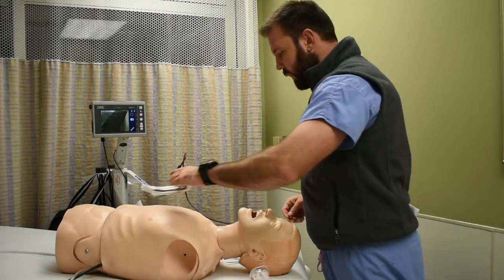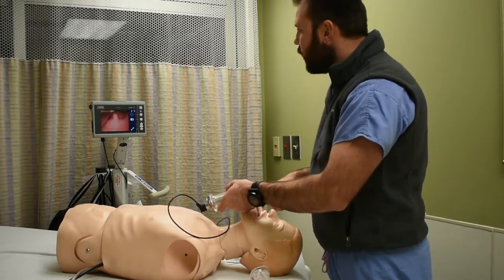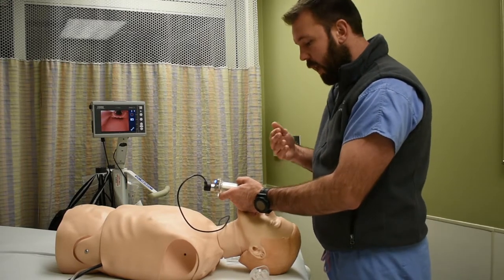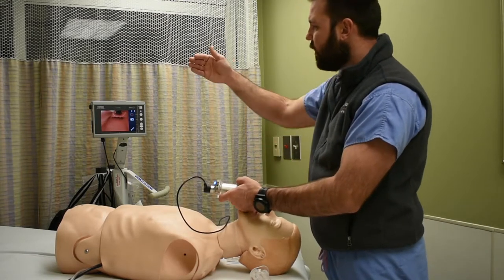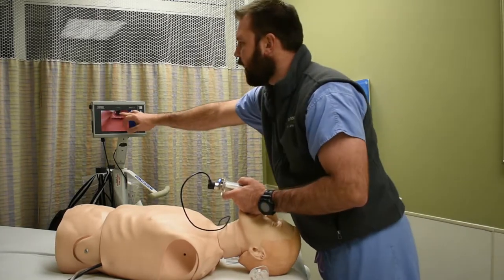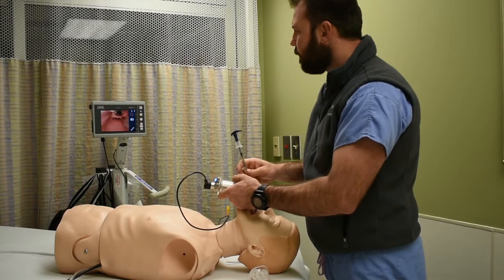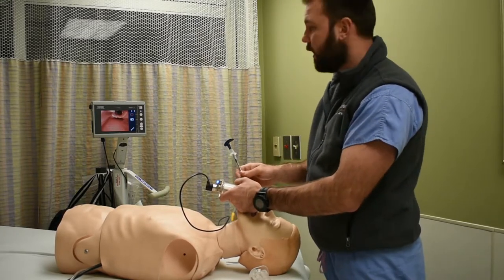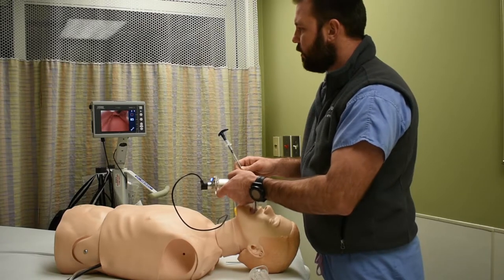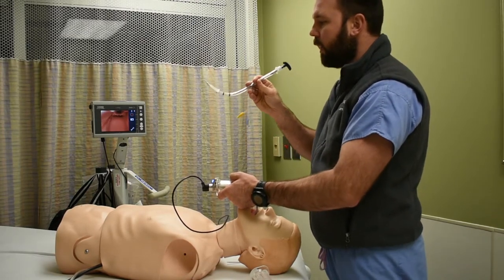The steps are basically the same — use those four discrete steps to look into the mouth, navigate behind the tongue, look up at the screen, and get a good view. The pitfall here is actually getting too good of a view: being too close to the glottis, or having the glottis in a grade one view down in the middle of your screen. You actually want the glottic opening in the upper one-third of your screen. If you're too close, you're likely past the vallecula and you won't be able to get the tube in.